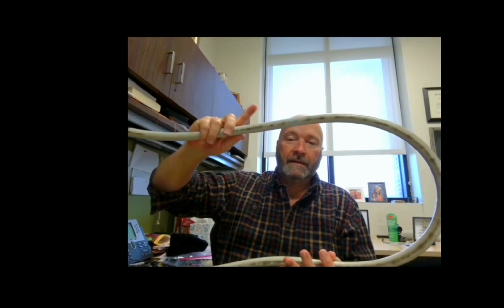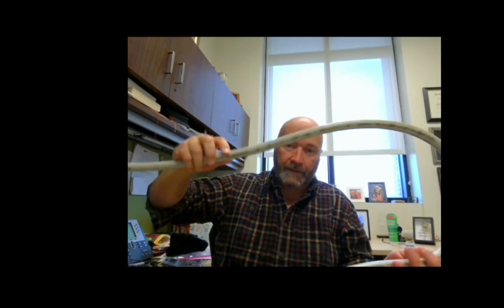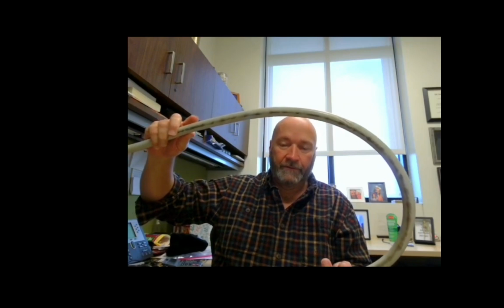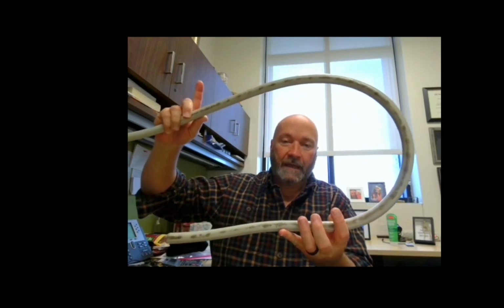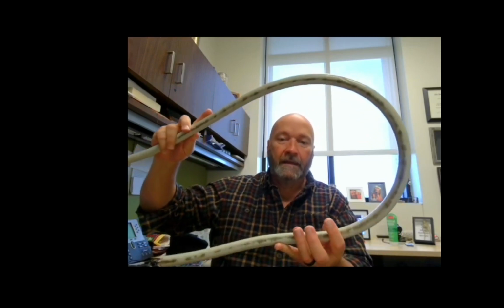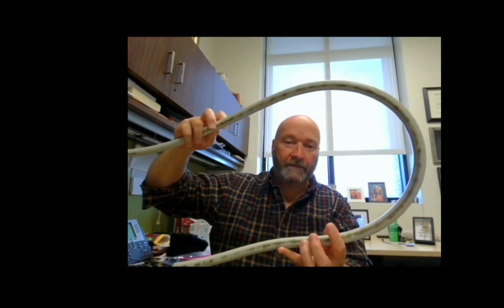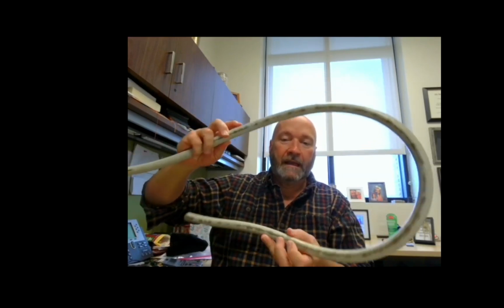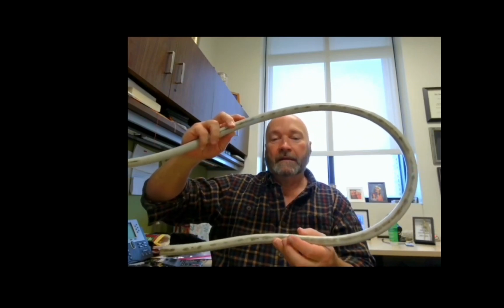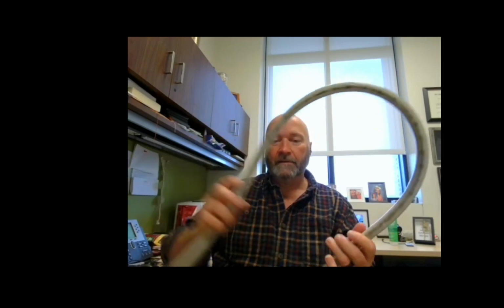So what we're going to see then is, if this is the patient's left, that will be your splenic flexure, and your hepatic flexure is over here. We're going to see air on the lateral side of the ascending colon, and barium on the medial side of the ascending colon. And then we're going to see air on the medial side of the descending colon, and barium on the lateral side of the descending colon.